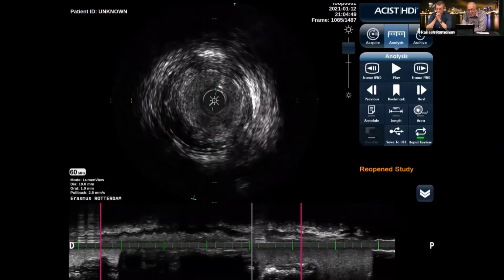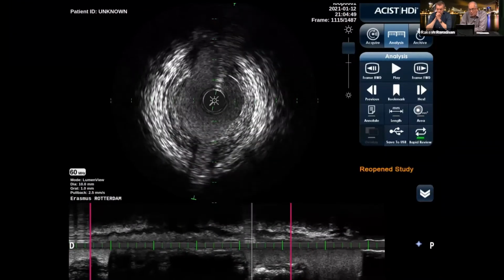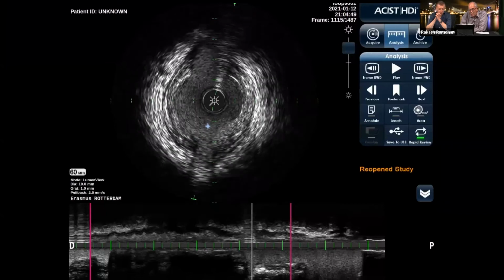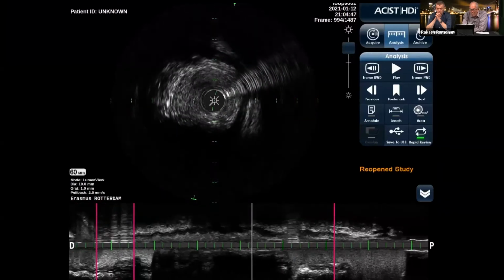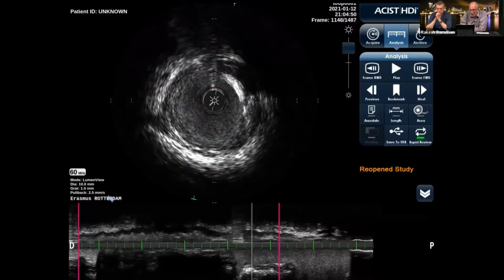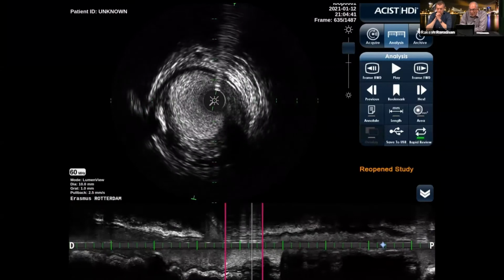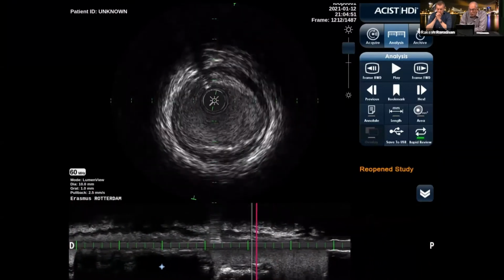It's in there, and now with two side branches, you can see that because of the two side branches, there is more flow because the blood can stream through the side branches. And that is the difference between flow in a blood vessel and no flow in the blood vessel. So this is the part that you want to treat. That is the culprit part.